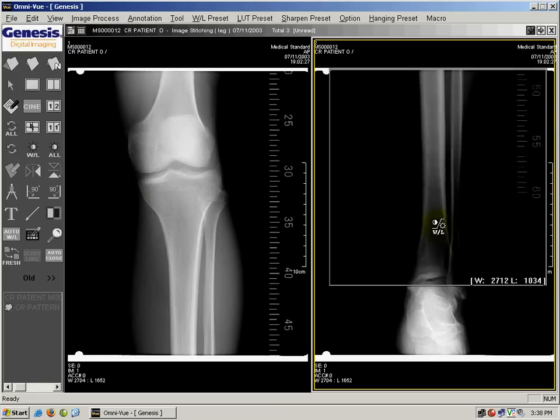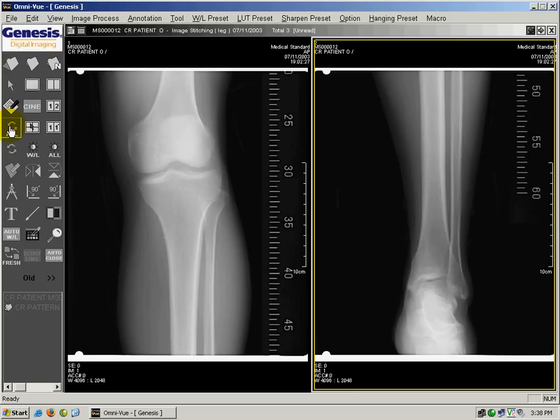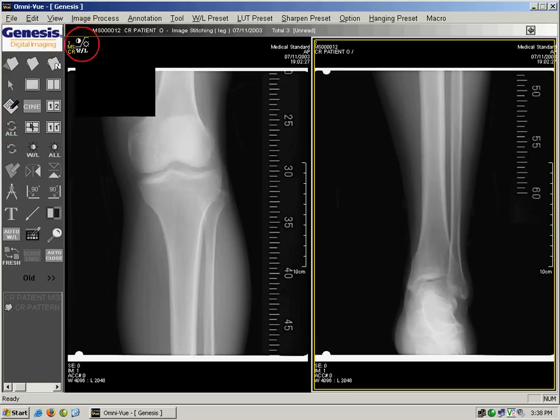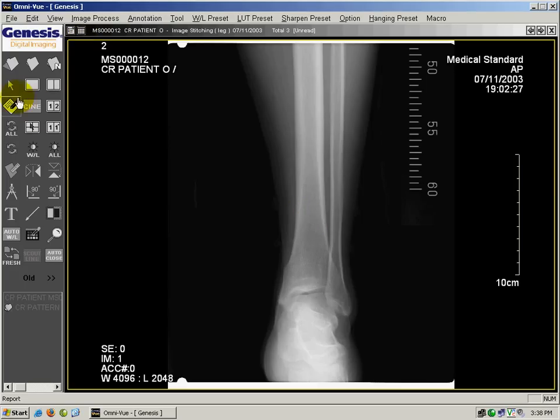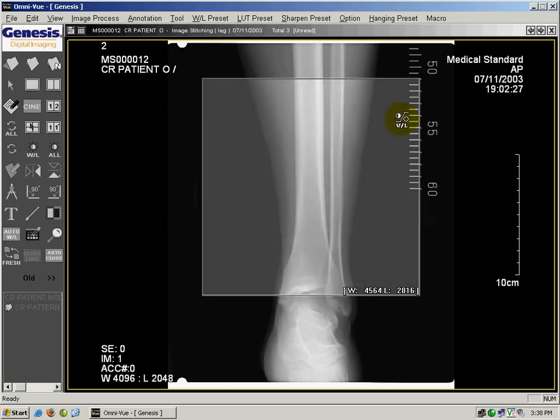I can revert one image back to normal by clicking display original, or I can display original on all the images and it will refresh everything back to normal. By default, if you want to window level without clicking the button, it's set as your right click on your mouse — so I'm going to hold the right click button and move my cursor and it's going to automatically window level.